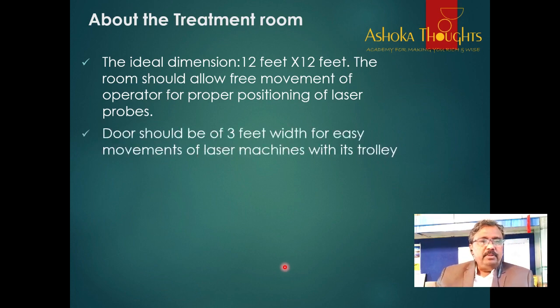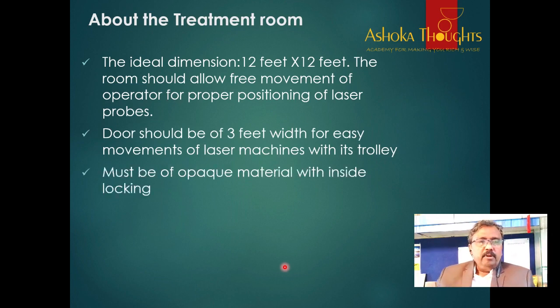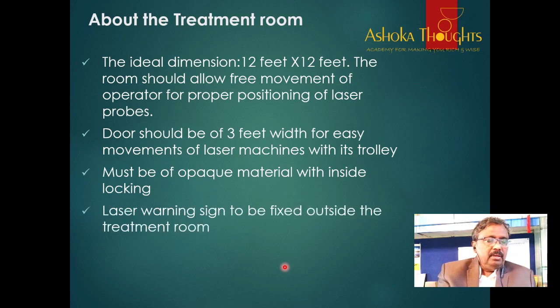The door should be 3 feet wide for easy movement of laser machines with their trolley in and out. It must be of opaque material with inside locking. The laser ray should not go outside the room. There should be a locking system inside the door. A laser warning sign is to be fixed outside the treatment room.